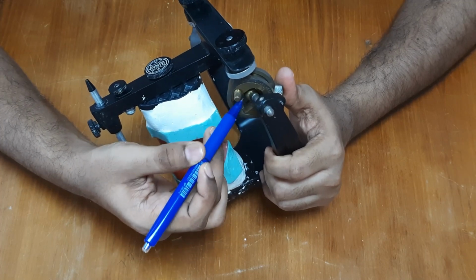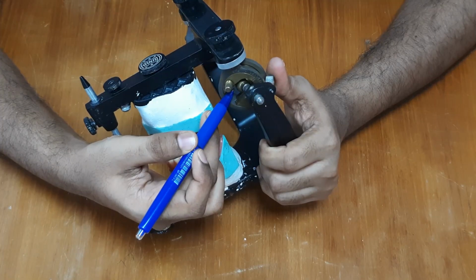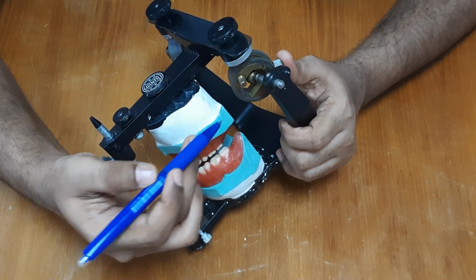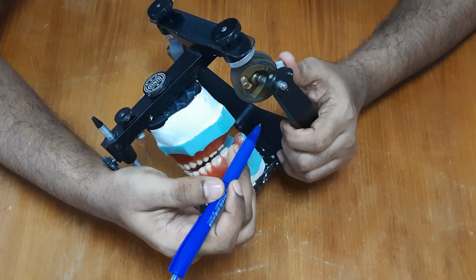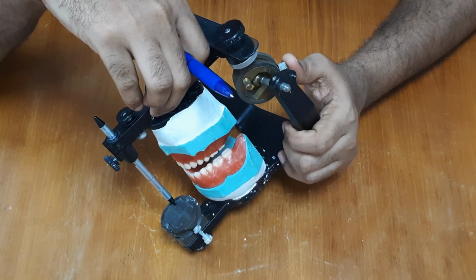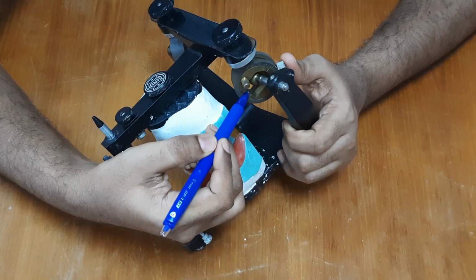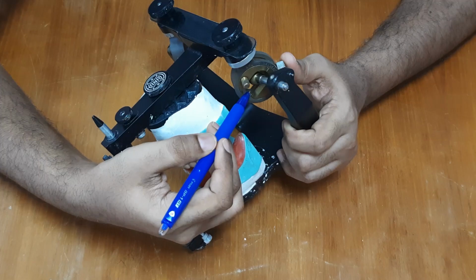It has a slot or track in the center. This track or slot can be opened or closed. This is a closed slot because it has a complete circular frame, whereas an open slot will be open at one end and it will be a U-shaped frame. The open slot helps for easy removal and reattachment of the upper member. This inclination of the condylar track can be customized for each patient using a pantograph or records obtained from graphic tracing.